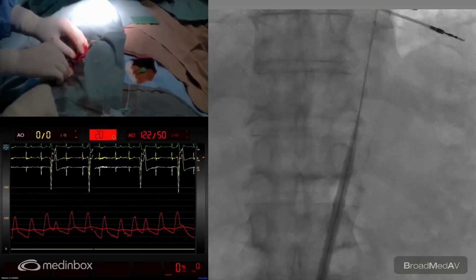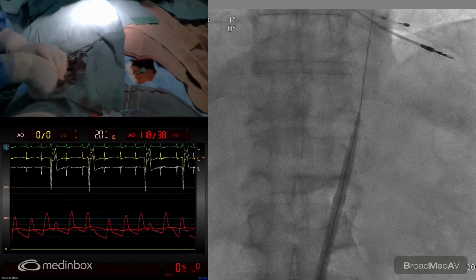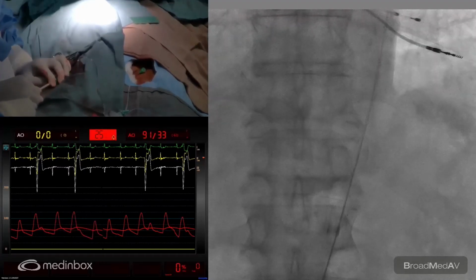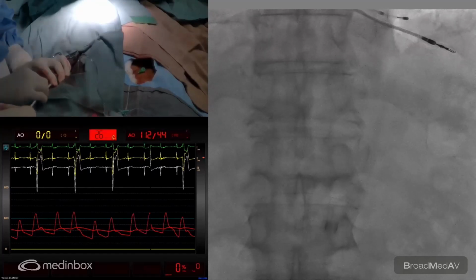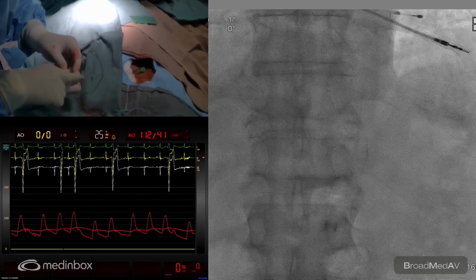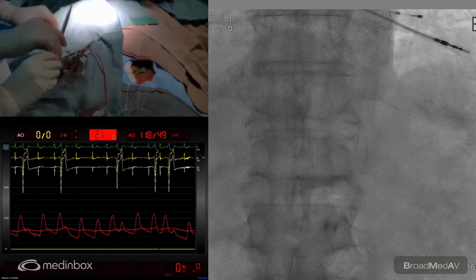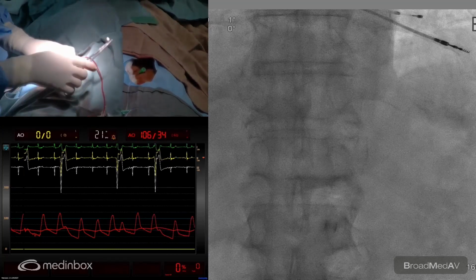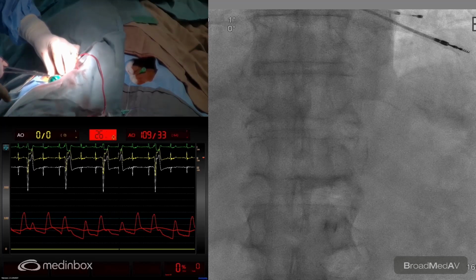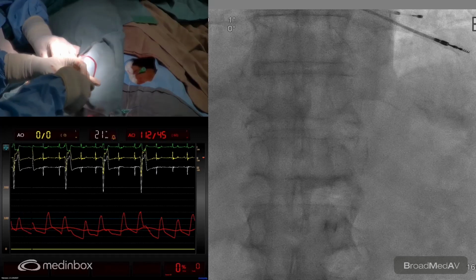So we've got that in now, and we'll now slowly remove the dilator and suture in the sheath. We'll take out the wires. Okay, so we get that out. Get me a suture, please. Give it 25 ml flush. 20 ml syringe. By the time Ashish takes the suture in, we'll get the pigtail ready for the left side. So sister, can we get the pigtail, please?